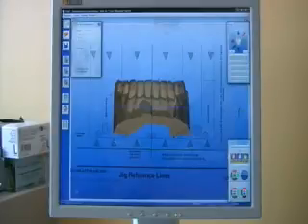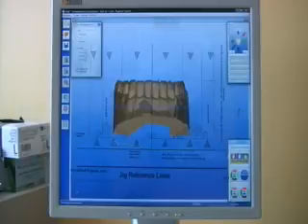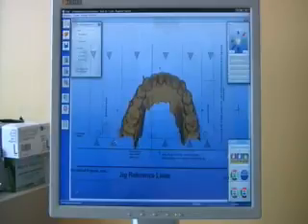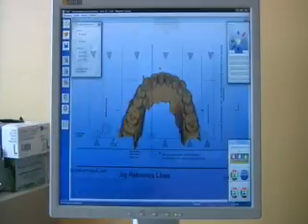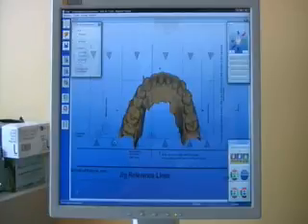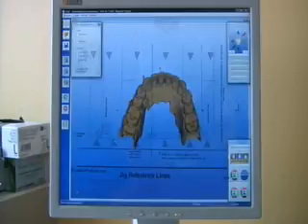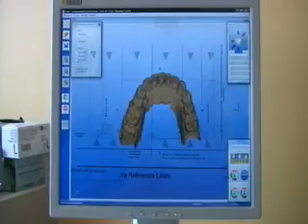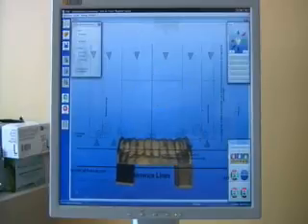We will then encircle the base of the mandibular model. Double click that, and allow the software to trim the model. Do not rush this step. If you see the busy symbol on the screen, allow the software to do its job. After the operation is complete, if we rotate it to the facial aspect, you will see how we have a nice flat plane as a base for the mandibular model.